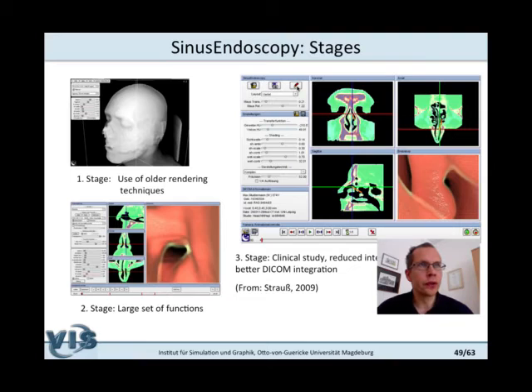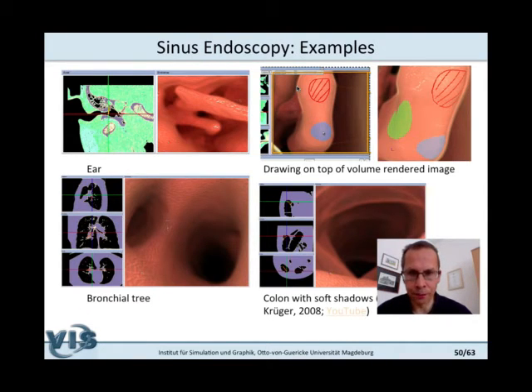So this type of surgery is carried out by an experienced physician. In German, we would say a Facharzt, with a completed specialization in ENT surgery, and he typically is assisted by a younger surgeon who is still in his education. And it's of course a good idea if both briefly discuss in advance how the surgery is planned, so that also the younger surgeon has an understanding of what he may expect.